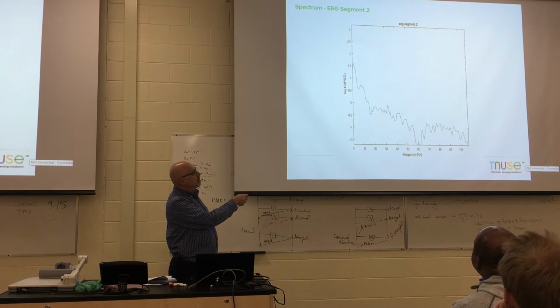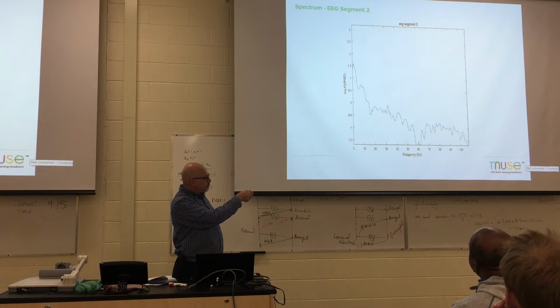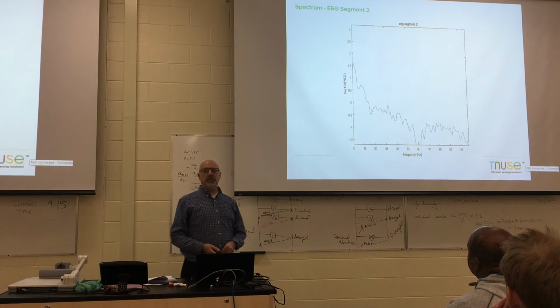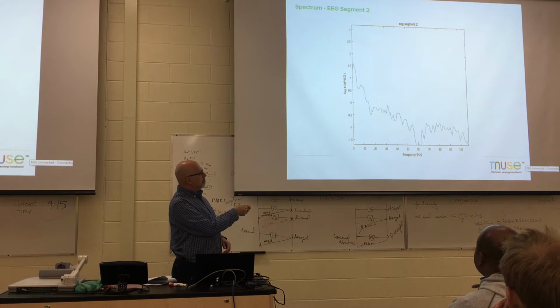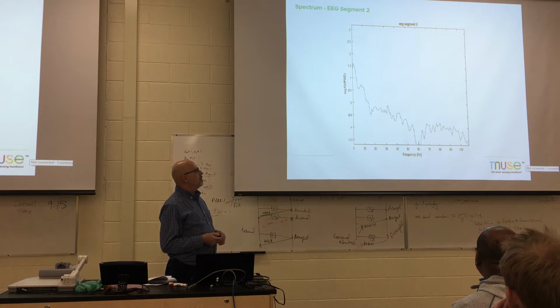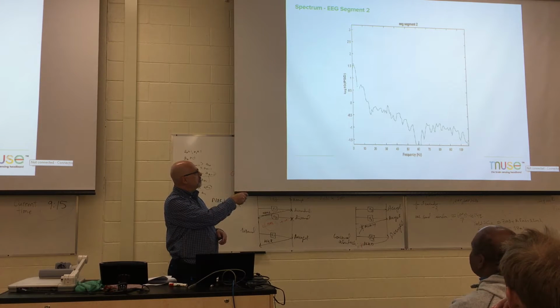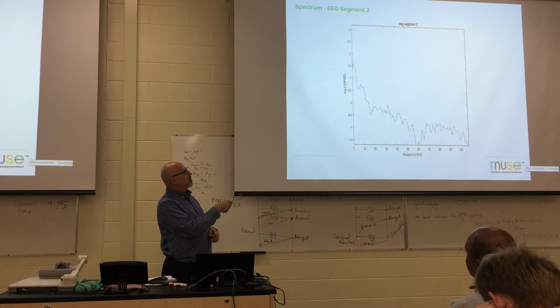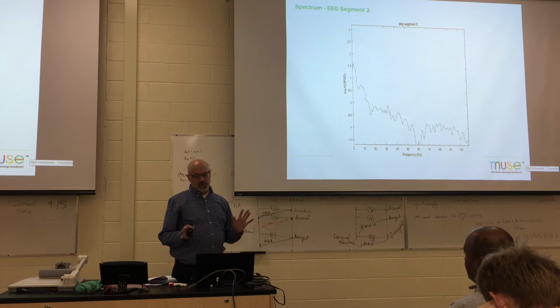You can see that delta, the low frequency, is strongest, and then it tails down. Most of the energy in the brain signal is in about 0 to 40 hertz. There are some papers that say we can get energy higher than that, but it's really hard to distinguish it from background muscle noise. Muscle noise will go from 20 hertz, even lower, all the way up to 100 hertz. And here you can see a 60 hertz notch filter that we applied in the headband to remove AC noise. Typically EEG has this curve in terms of the spectrum, which goes 1 over F with respect to the log of the power. If you see that shape, that's a good indication that you're actually seeing some brain signal, but it's not a guarantee.